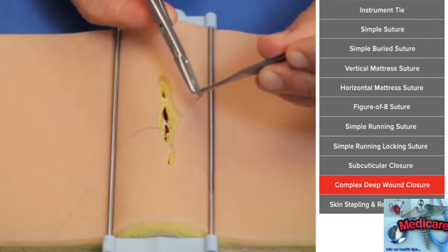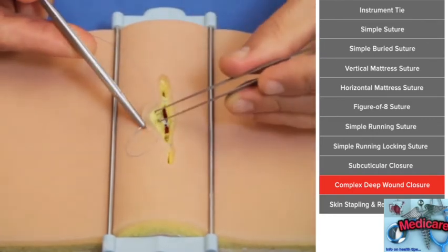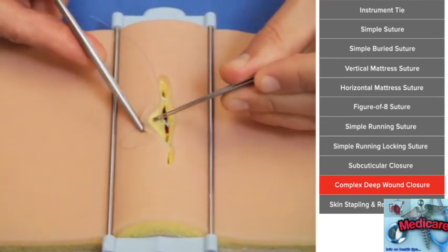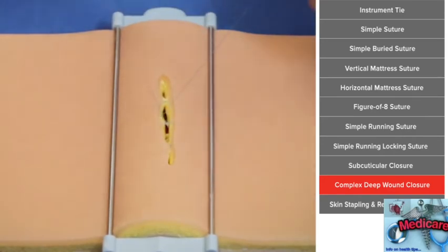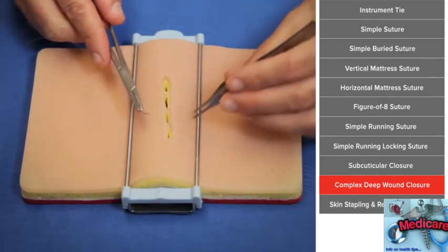Notice I'm grabbing deep dermis, starting deep, coming superficial, and I'll grab right above the dermis on the other side, come out the same distance, and when I tie it together then, what we're doing is getting these skin edges closer together and getting them closer together at about the same level, so that when we're finally closed and the skin is closed, we have a beautiful closure.